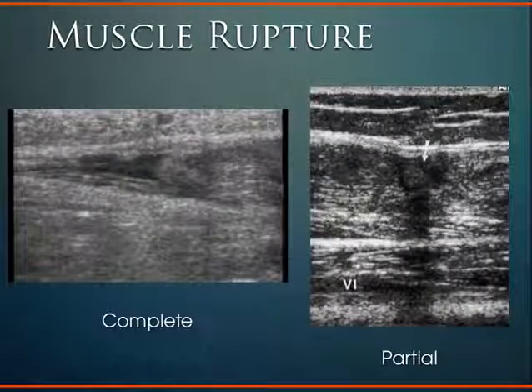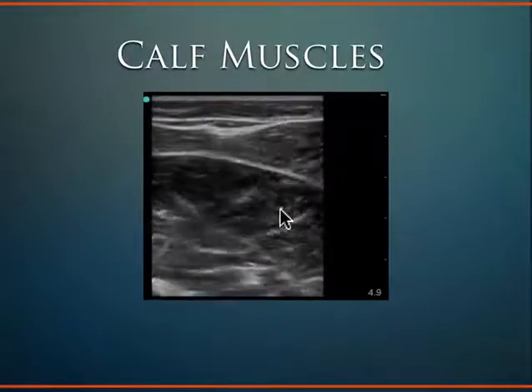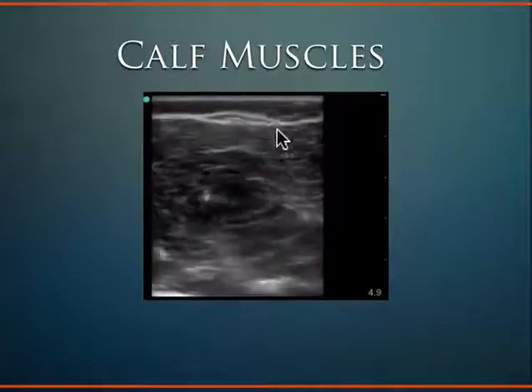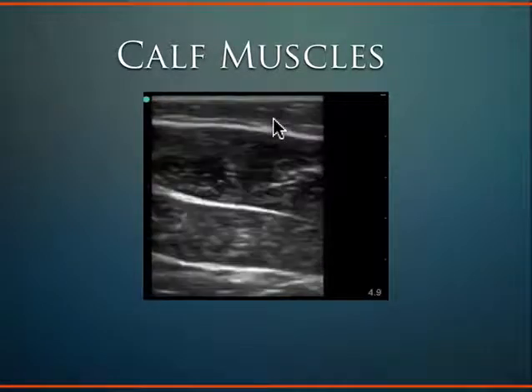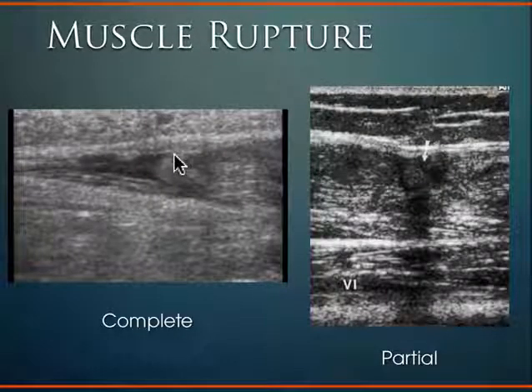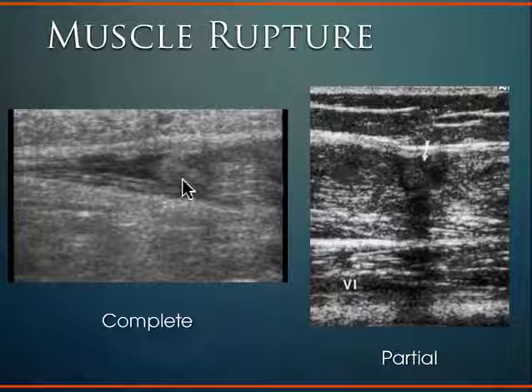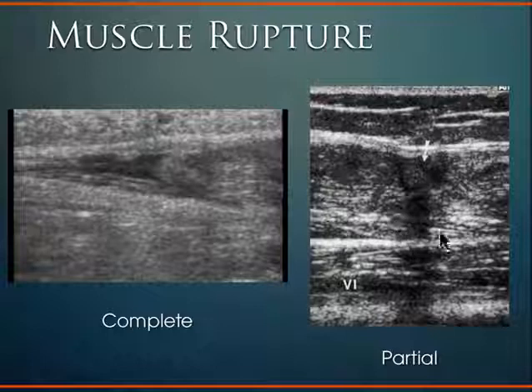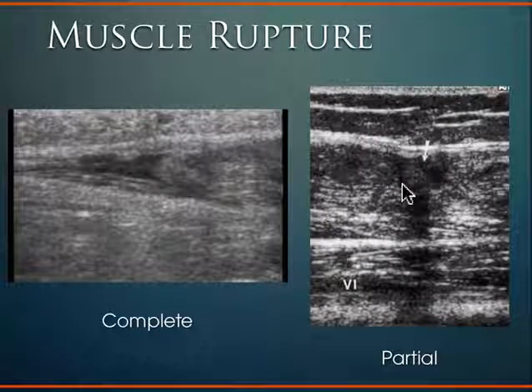This is a nice longitudinal view of a calf muscle showing connective tissue planes and the fibrillar pattern of the muscle. For muscle rupture — just like the tendon — you'll see the retraction or stub of the actual muscle tissue. That should be connected here but you can see the muscle tissue is retracted. For a partial tear, you'll see maintenance of connective tissue fascial planes but intrasubstance partial tearing of the muscle, disruption of muscle tissue, and maybe a localized hematoma.